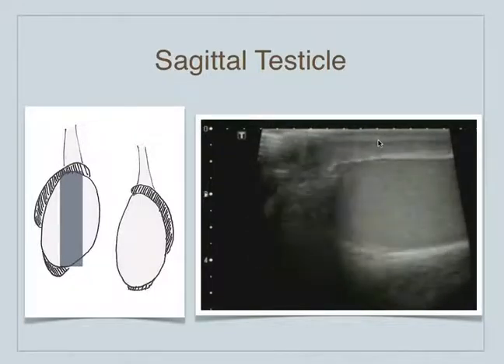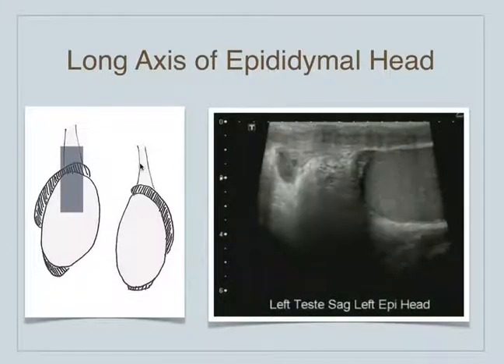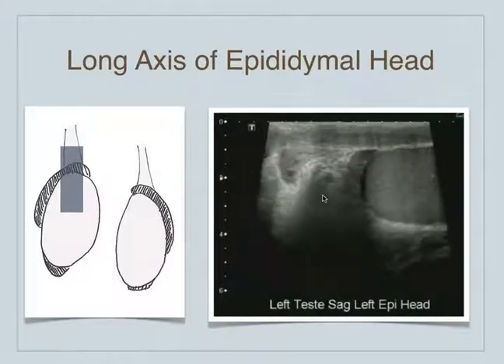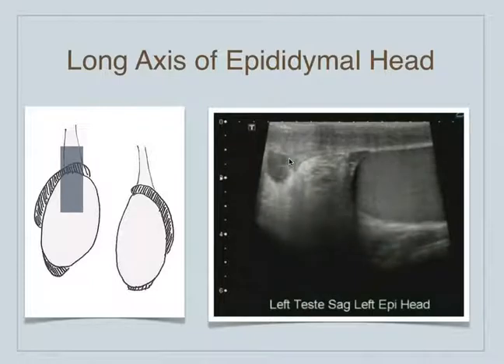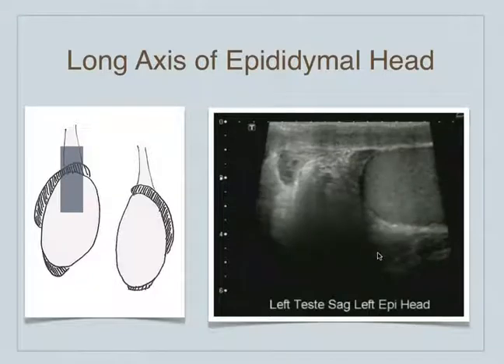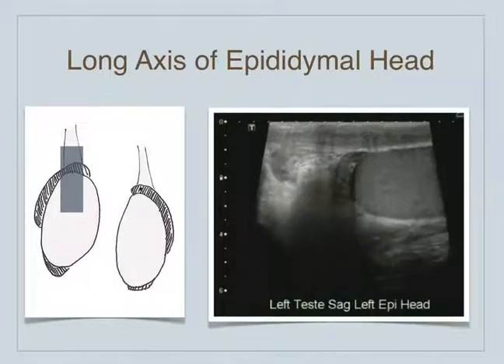Then we move the transducer a little bit more superiorly. Now we're along the long axis of the head of the epididymis as it comes around here. We can see it just along here with the spermatic cord seen up here — so spermatic cord, head of the epididymis, and then the superior portion of the left testicle seen here.